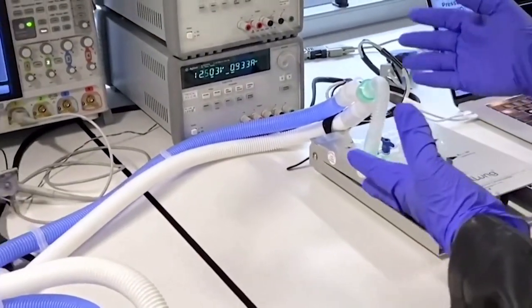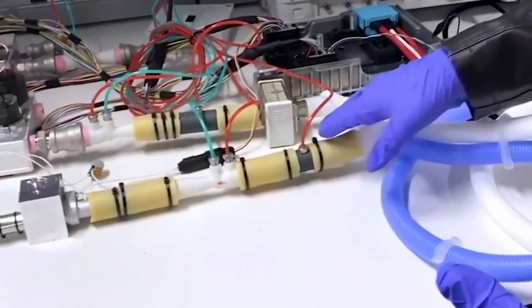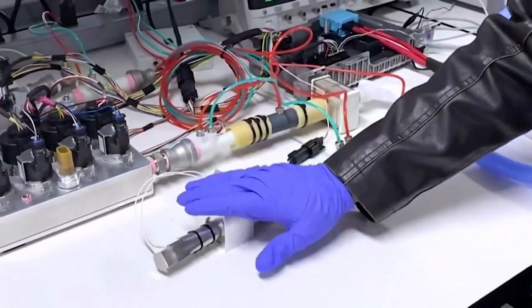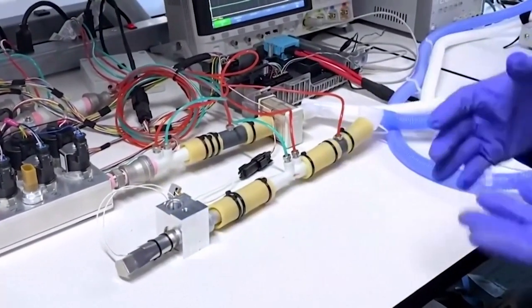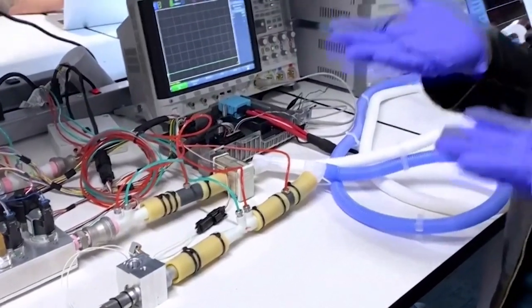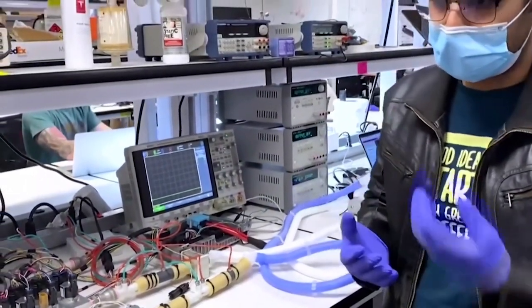Then the air goes through a valve and then goes to another sensor, and then goes to a PEEP valve which is used to control the protection of the lungs. So this creates positive pressure on the lungs which helps the patient breathe.